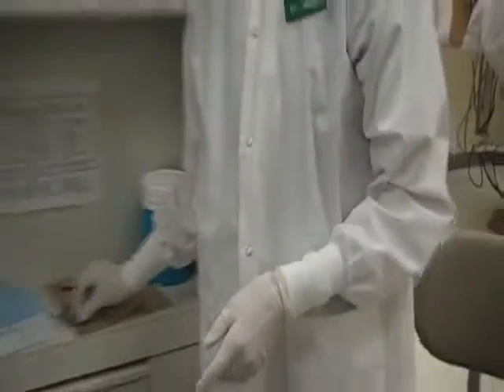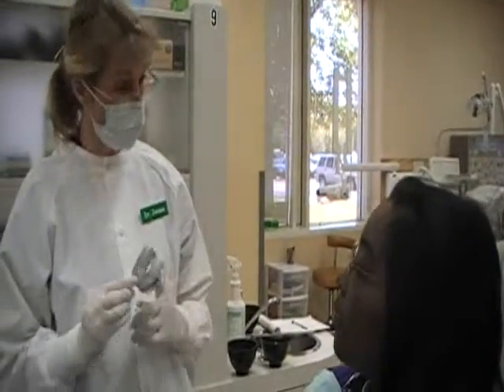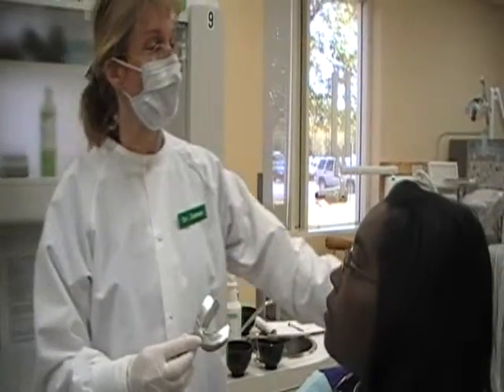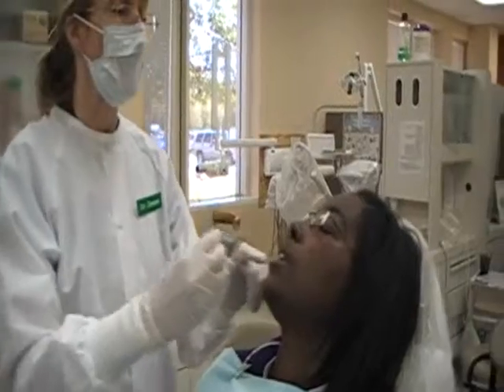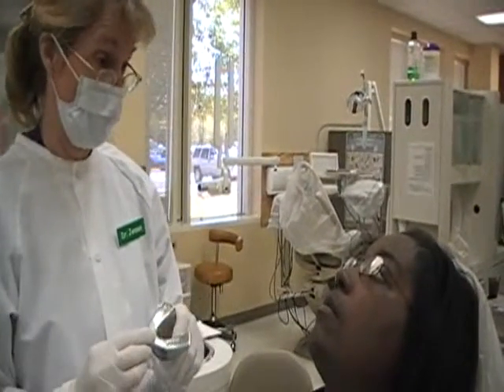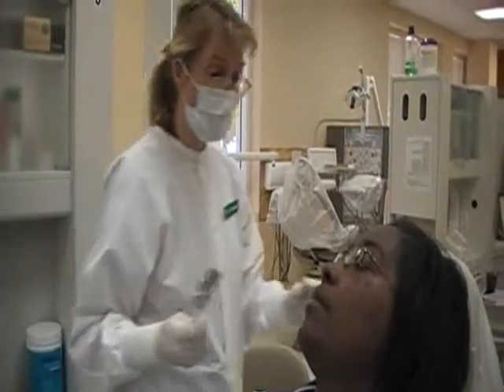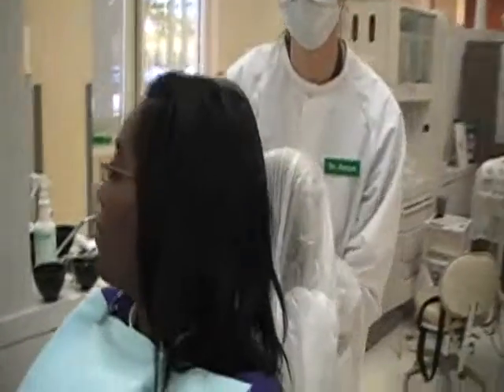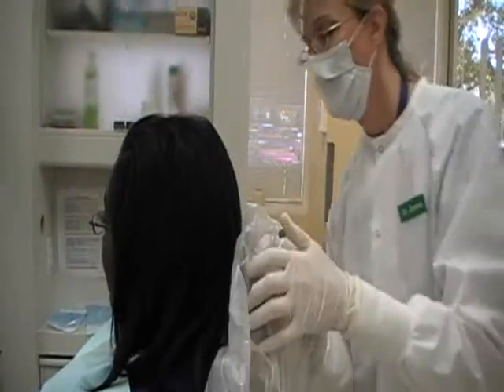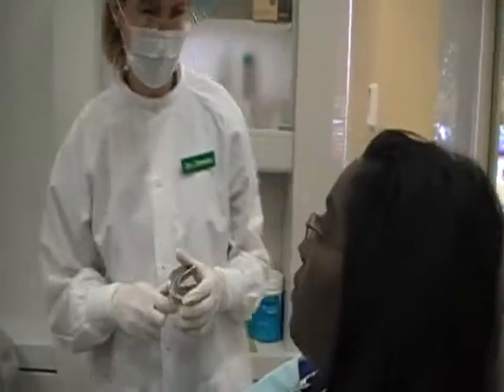Before I mix the alginate, I want to go over some things to expect. We're going to be doing the lower first. When I place it in your mouth, I want you to lean your head back a little bit and stick your tongue out at me once I place the material. I want you to breathe through your nose, not your mouth. I also want to put this in a more forward position. Do you have any questions?